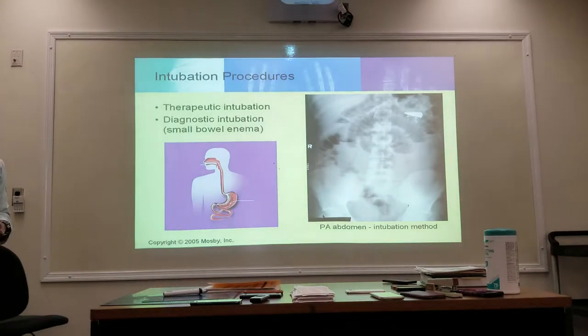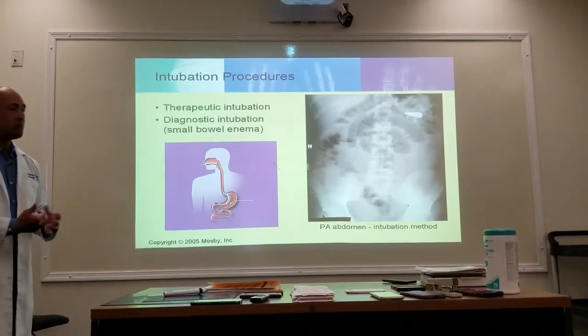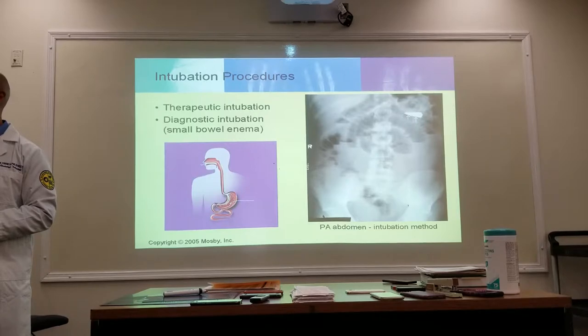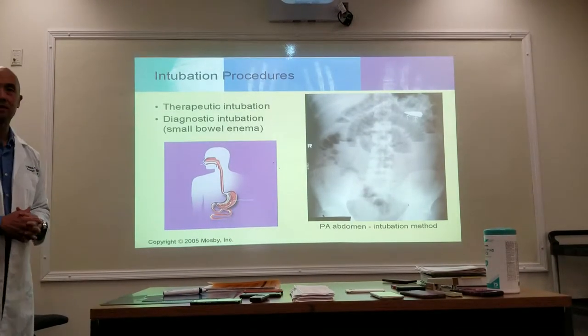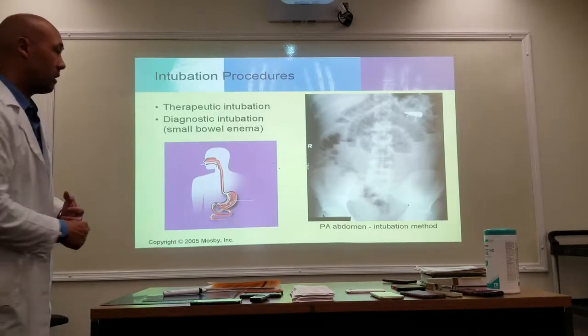Again, this is done under fluoroscopy. We don't want to blindly put that tube down there. With the aid of peristalsis and some rhythmic segmentation, we are able to position it. Once we get contrast in there, again, they're just KUBs, timed KUBs, and we keep going until the entire small bowel is filled.